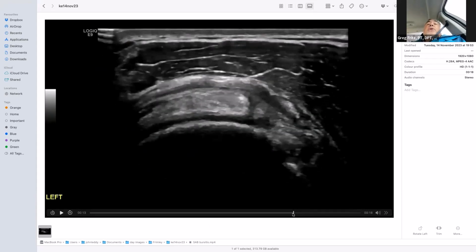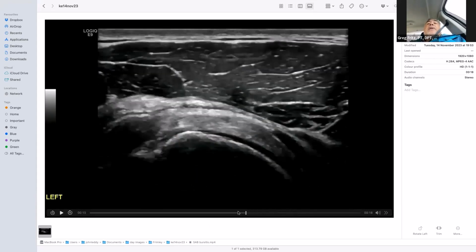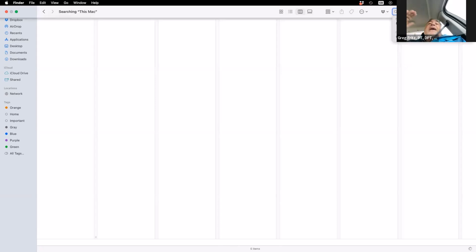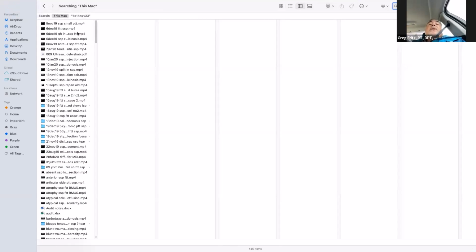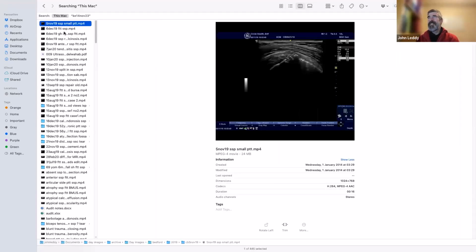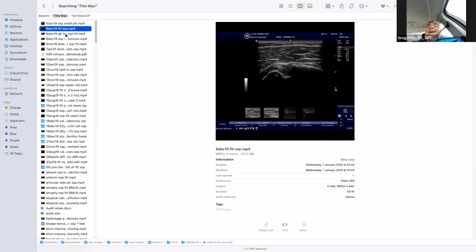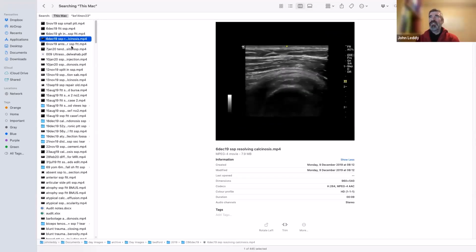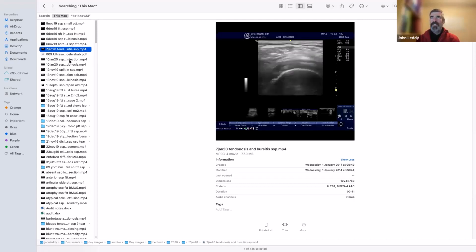As you look at the slope angle, there are some people that will say, now you're off of supraspinatus and you're on to infraspinatus because the angle has flattened. Am I making sense to you at all? You're making sense to me. Do I agree? Probably not. Or no, it's not true that I would disagree. I just wouldn't, based on what I see, that would not be how I would choose to describe it.